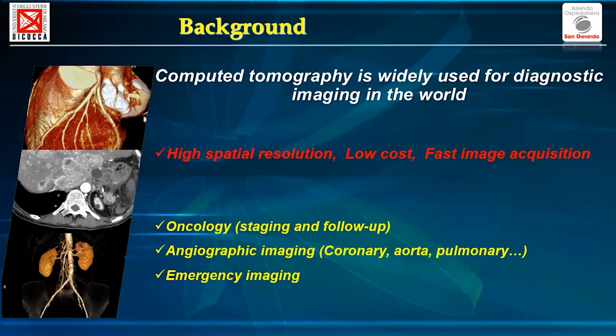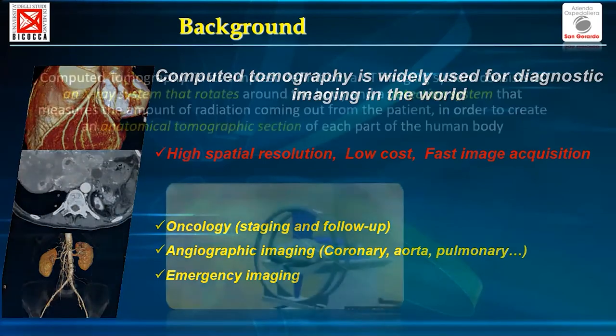In the last 10 years, the importance of CT is increasing a lot with the coronary CT, because we can recognize the small coronary arteries, and we can provide prognostic information regarding the development of myocardial ischemia. And obviously, the CT is the best technique in the emergency department, because it allows us to solve most of the problems in everyday life.